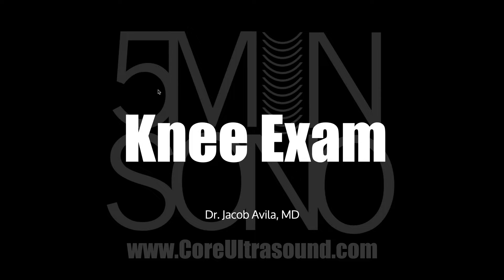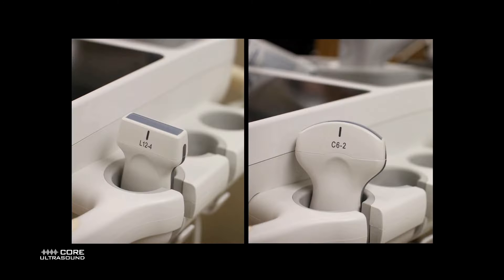Hello, my name is Jacob Avila of Core Ultrasound, and in this 5-Minute Sono video, I'm going to walk you through how to do a basic knee examination using your ultrasound.